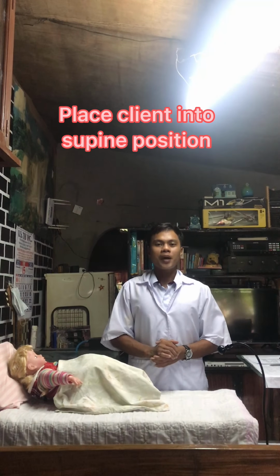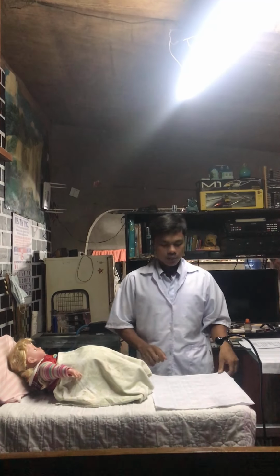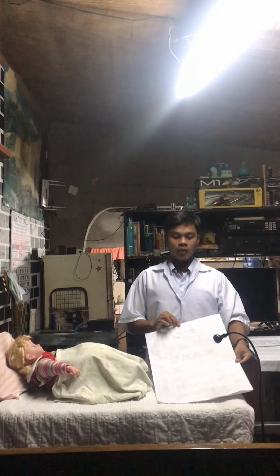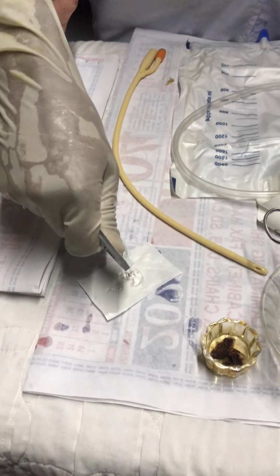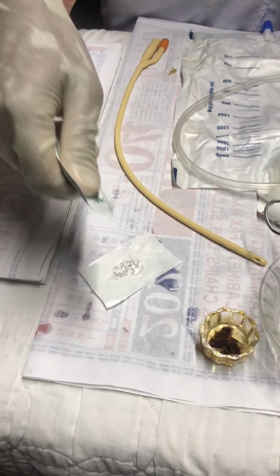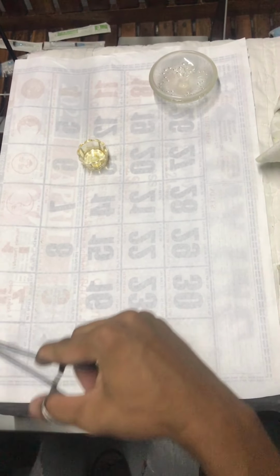Place the client into supine position with feet apart and drape the client to have a good visualization of the meatus. Observe aseptic technique, sterile technique, to protect the client and prevent the spread of microorganisms. Imagine that this is a sterile OS and this is a sterile field. Squeeze a small amount of lubricant over the sterile OS placed in the sterile field. Using sterile pickup forceps, get 2 cotton balls with betadine antiseptic solution from the sterile jar and place them on the sterile field.